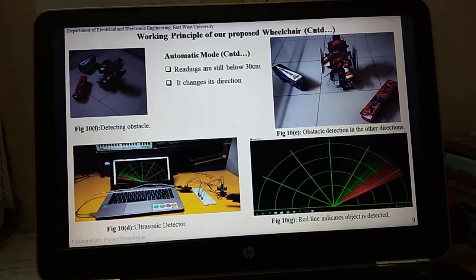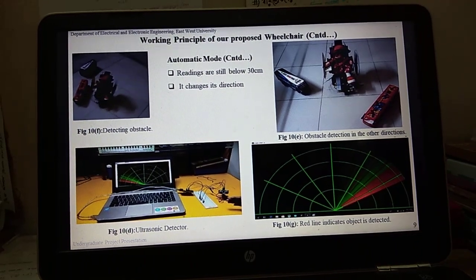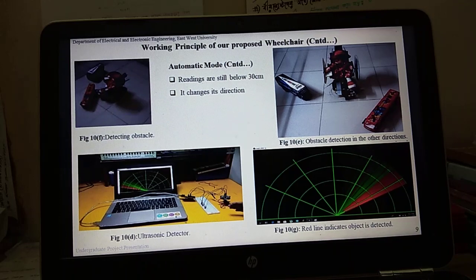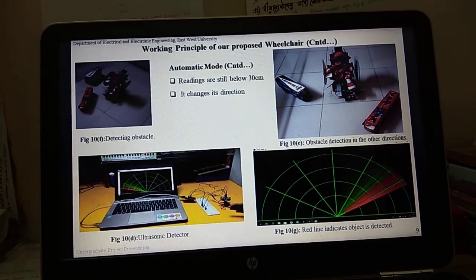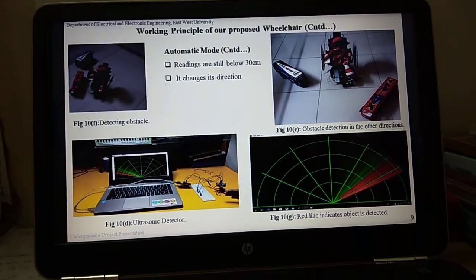While moving in other directions, again it detects obstacles in different positions. In that case, it changes its direction and the ultrasonic sensor continuously calculates the distance between the wheelchair and obstacle in front of it, and will turn to the side which gives maximum result.